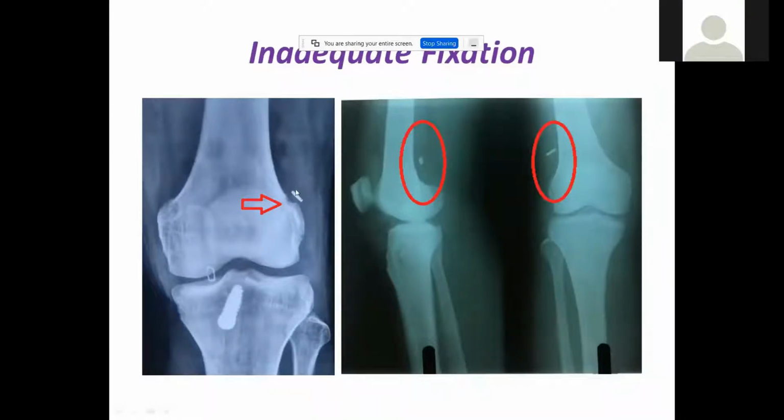Here you can see the femoral endobutton is lying in the muscular substance. It is not good. Here you can see the graft. There will be a tunnel blowout. That's why the femoral endobutton has landed so high up compared with the normal tunnel. You can see these pictures, and this graft is not going to suffice because the fixation is not enough. When the patient bends his knee, the graft will not be stabilized.